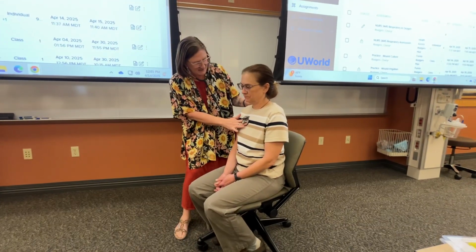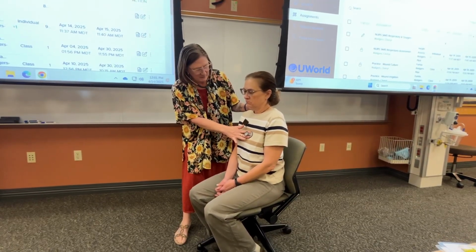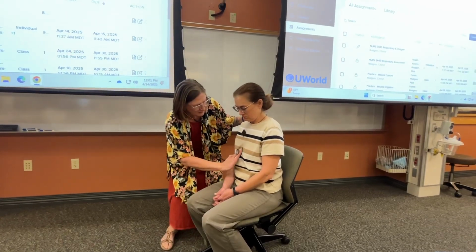And if you start to feel dizzy, you just let me know. You can definitely pause. And then remember, you go straight down in that ladder pattern. You're listening to those lungs.